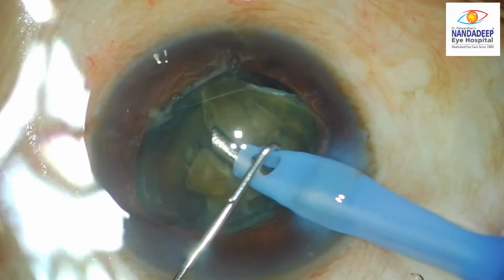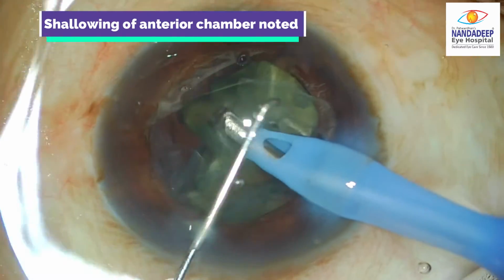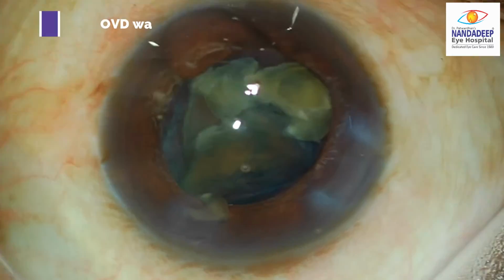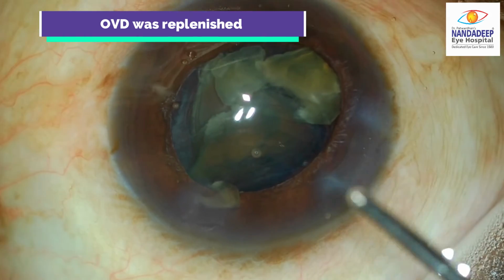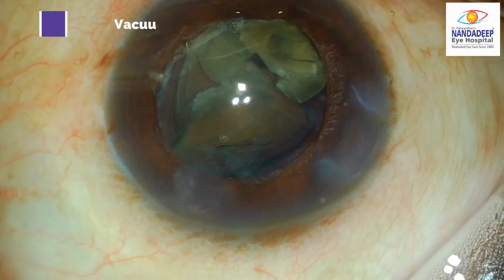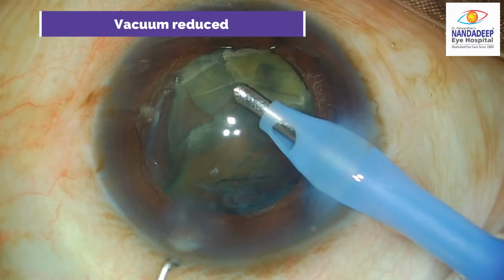So let's look at this particular case. The surgery was going on as usual, but the surgeon noticed there was shallowing of the anterior chamber. So the surgeon stopped and replenished the anterior chamber with OVD, trying to push the pieces back into the bag.